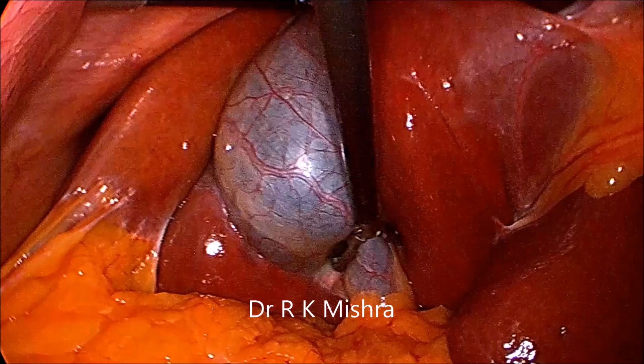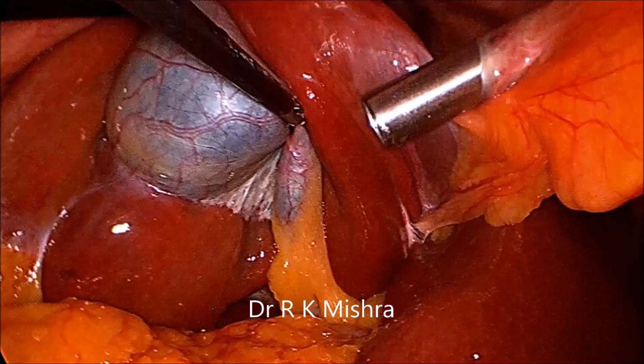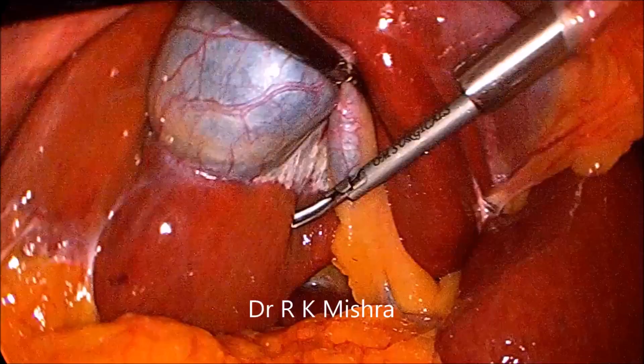Hello, this is a video of laparoscopic cholecystectomy. The fundus is pushed towards the right shoulder and the Hartmann's pouch is giving anteromedial traction. Here we can see the Rouviere's sulcus. This is Rouviere's sulcus.